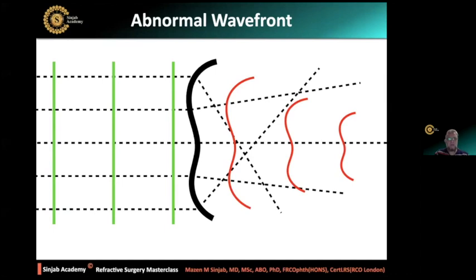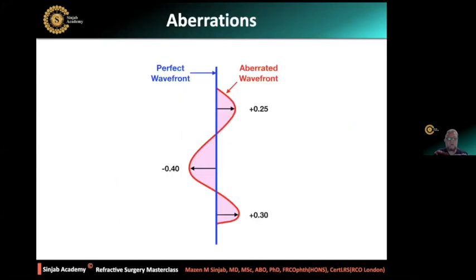As you see, these wavefronts in red are not curved and not straight. So they are distorted.